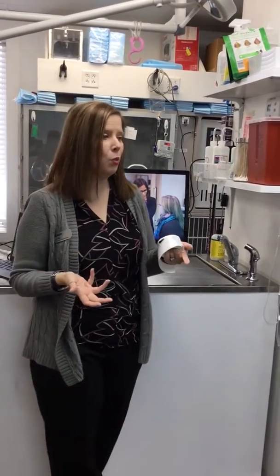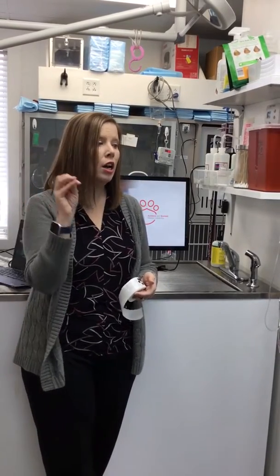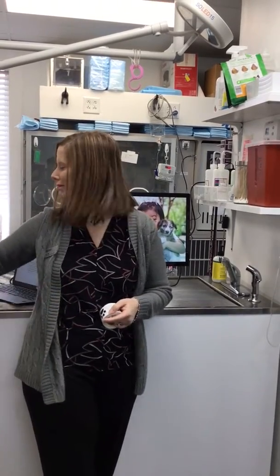But let's say that has to happen. What you need to do is write down the patient, the clip that you used, and why. If you get an error, like an aspiration error, and you need to run that specific slide, write down the patient and the error, because we need to follow those errors. Idexx needs to know that to make sure it's not something wrong with the analyzer, and what you used, like a Chem 17 or whatever. It needs to be called in within about 2 weeks to get that credit. So it's okay, but yeah, they're no good.